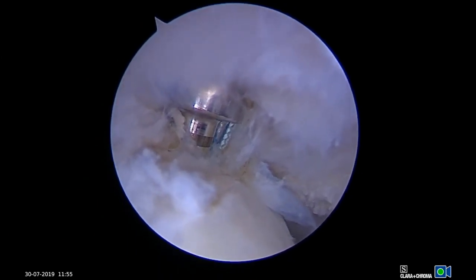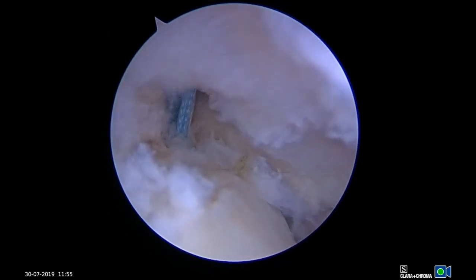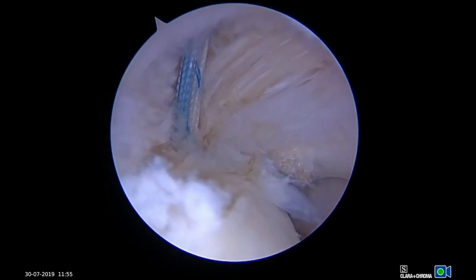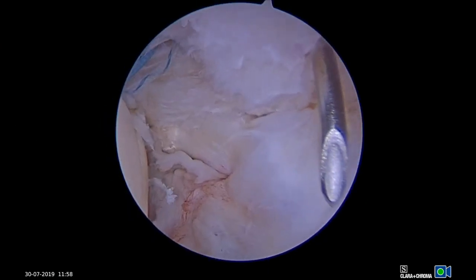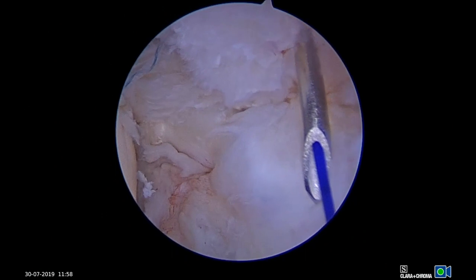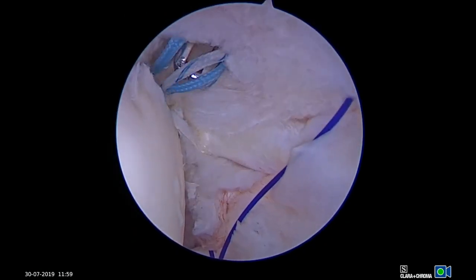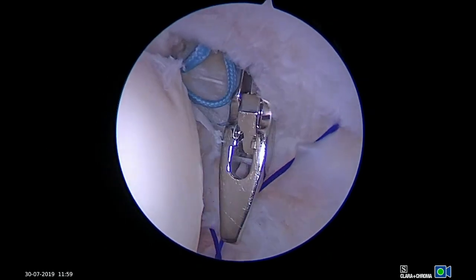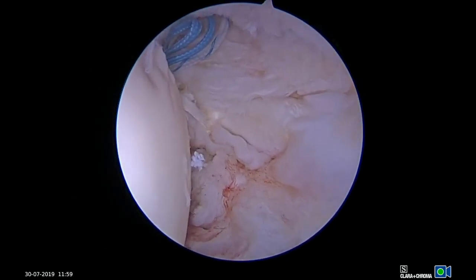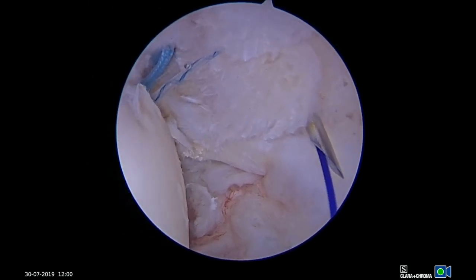Next, sutures are passed in mattress fashion using the surgeon's preferred passing technique. We use an 18-gauge spinal needle and PDS suture to increase the accuracy of suture placement. Another advantage of the bursal split technique is the ability to place a grasper through the split to grab and pull the retracted, articular-sided portion of the pasta lesion laterally, ensuring full-thickness suture passage without passing sutures too medially in the bursal portion of the cuff.